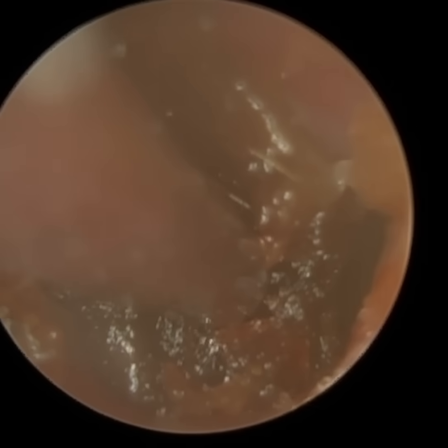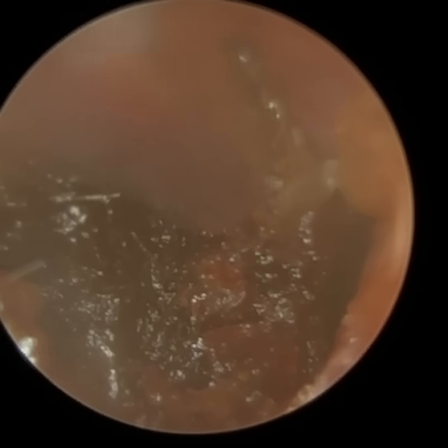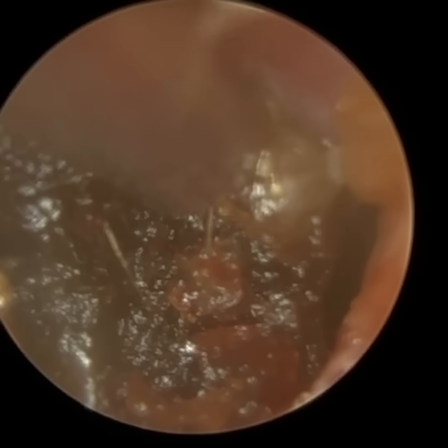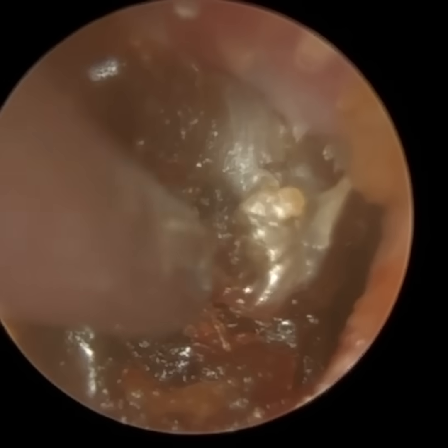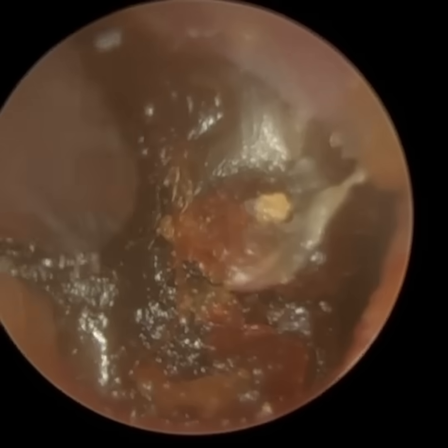And I'll come on to that, but I just want to talk about the procedure in a bit more detail before I do. So the reason why this procedure is technically challenging is that you would have seen in the midsection of the ear canal, they've got an extremely narrow portion of the ear canal, very stenotic. And for that reason, I wasn't able to use the normal Zollner suction probe.